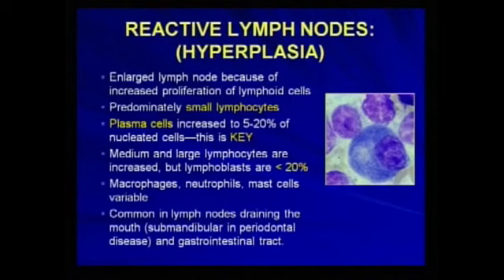Okay? Occasionally, you will see macrophages, you will see neutrophils and other cells, but they will not be the balance of the inflammatory cells. And you will see erythrocytes. Okay? There is enough room in that node for blood to go through, and the aspiration process will probably cause a bit of hemorrhage. So this is a reactive lymph node, it's a wide range of cell types.